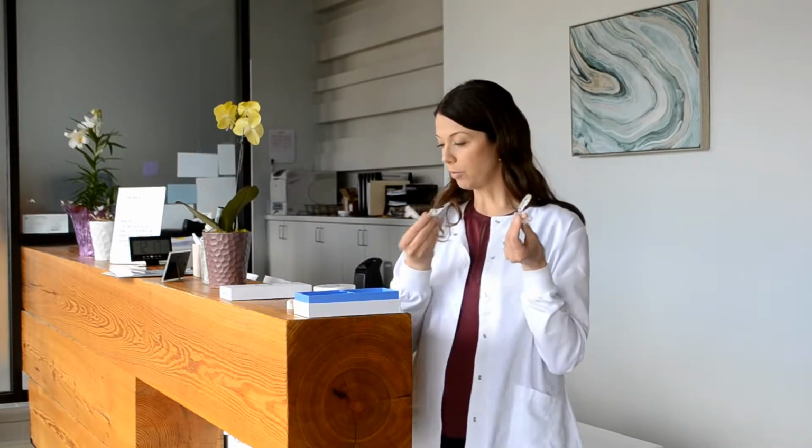The other thing I like about this particular device is that it is called lingualess. Lingual is for tongue, and that means that there's no material on the tongue. We talk a lot about tongue posture and tongue position and how important it is to have as much space in the mouth as possible for the tongue. And the last thing we want to do is put material by the tongue and not give the tongue any more space. So that's why we do that.